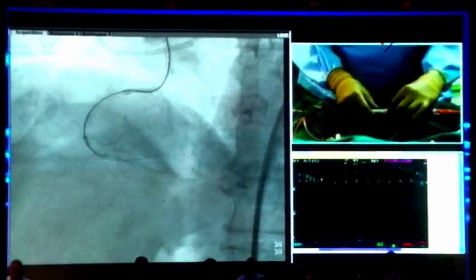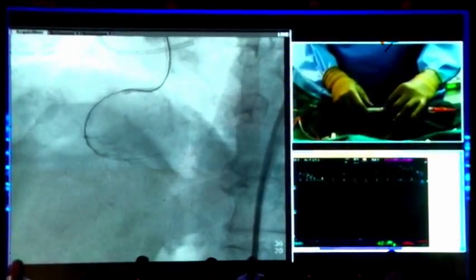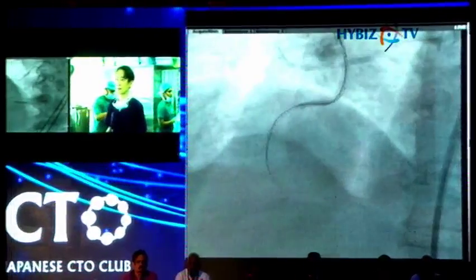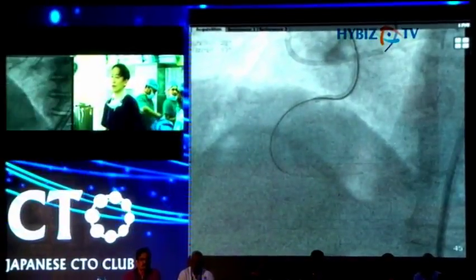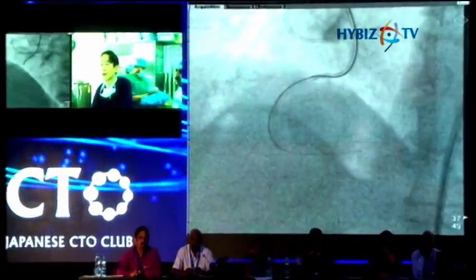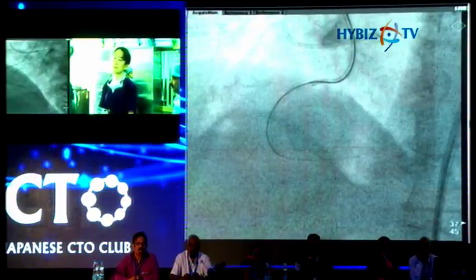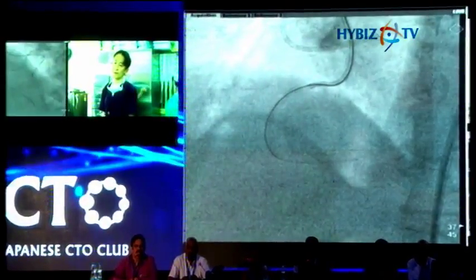Don't worry. Okay. So I've got 10 more millimeters to go, and I'm going to try not to advance it too far down, so we'll see how it goes. Okay, good. I just spin fast, that's all. It's really not a push, right? Okay, good. So now I want to see if I'm where I need to be. So guys, I want the following in the room. Is there anyone from Boston here who knows what we need?